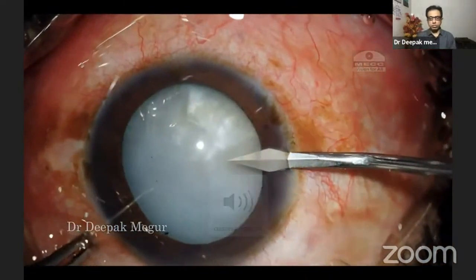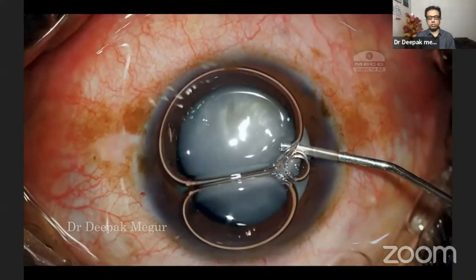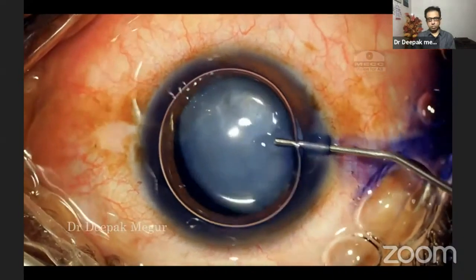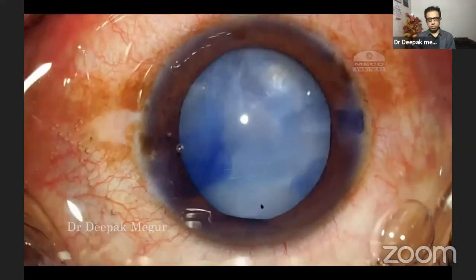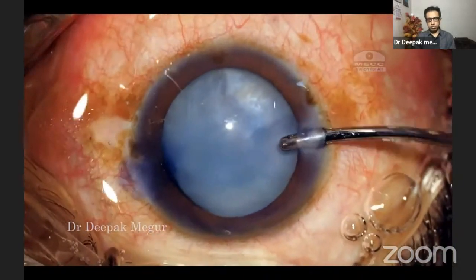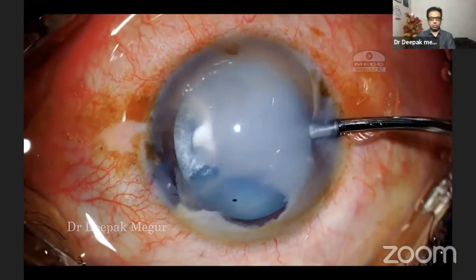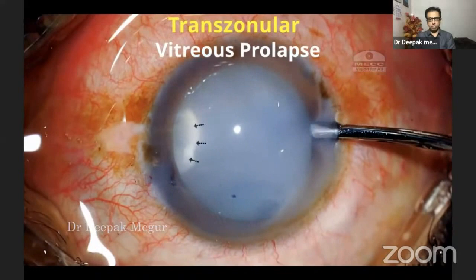I begin my case by doing two small paracenteses. At this stage, I'm not sure if there is vitreous prolapse or not. I'm using trypan blue as little as possible to stain the anterior capsule. At this moment, I see there is some amount of trypan blue leaking out from the area of the zonular dehiscence. I become suspicious and inject diluted triamcinolone acetonide to check for the presence of vitreous. And as you can see, there is a tongue-shaped vitreous prolapsing from the area of the zonular dehiscence.